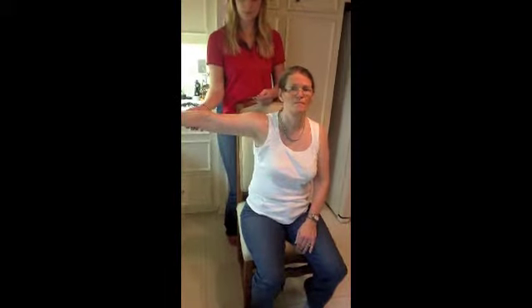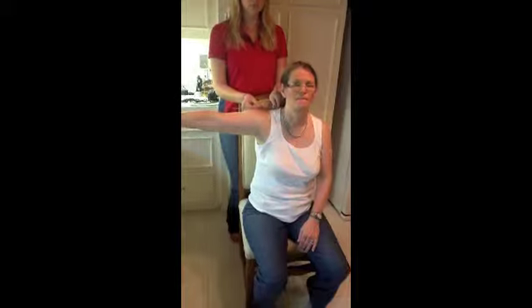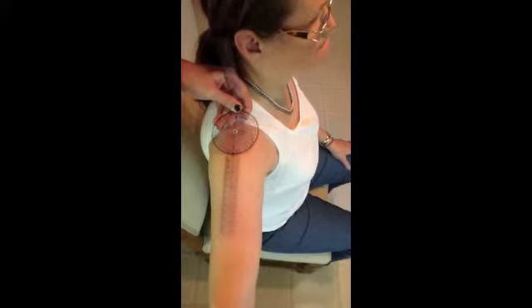Shoulder horizontal abduction, the subject is seated with the shoulder abducted to 90 degrees, the elbow extended with the palm facing down. The axis of the goniometer is over the acromion process. The stationary bar is parallel over the shoulder towards the neck, and the movable bar is parallel to the humerus on the superior aspect. The client's arm is moved toward the back of the body in the horizontal plane of movement. Measurement begins at 0 degrees and ranges to 40 degrees.